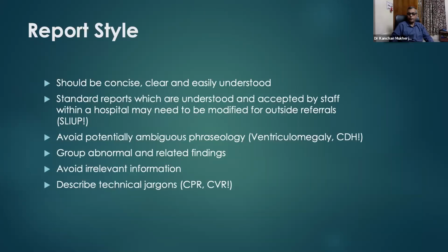Report style. They should be concise, clear, and easily understood. Standard reports which are understood and accepted by staff within a hospital may need to be modified for outside referral. Just 5 minutes back, Dr. Ghosh was suggesting that if you say BV, BT angle, it may be familiar to you or to your unit, but to an outsider, it may not be. Like if I write SLIUP, how can I presume that that is meant by single live intrauterine pregnancy?